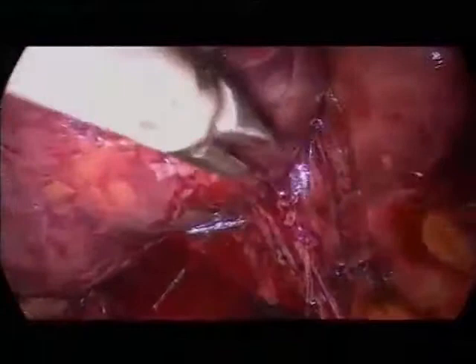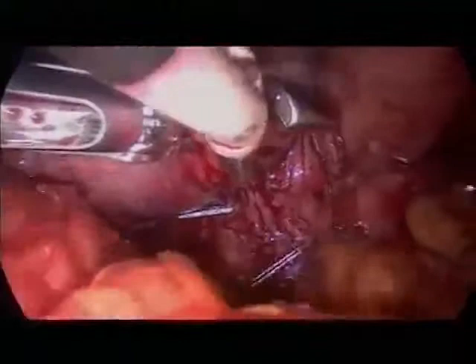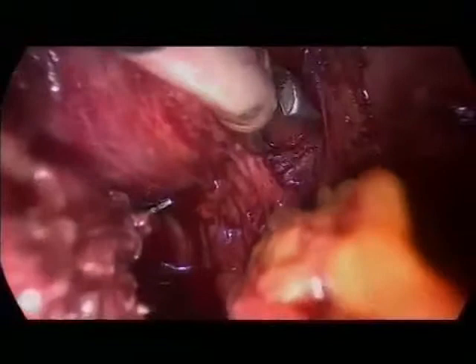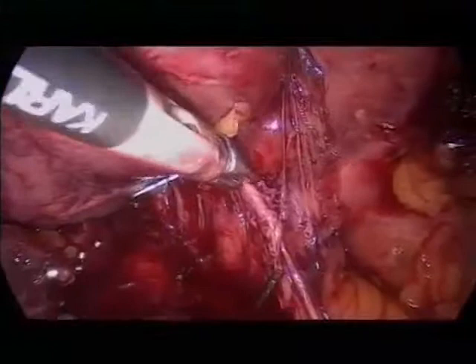That is right, but here it's extremely stuck. Very important. So that means that it is stuck, and probably will not remove all. Yeah, absolutely, this is a sign. If you have seen it on the other side, it's a kind of key. It's probably a risk for capsular penetration. It's very strong tissue here. Absolutely. Go a little bit more lateral. You see here, stuck. Normally, at this area, you can do all the dissection bluntly.